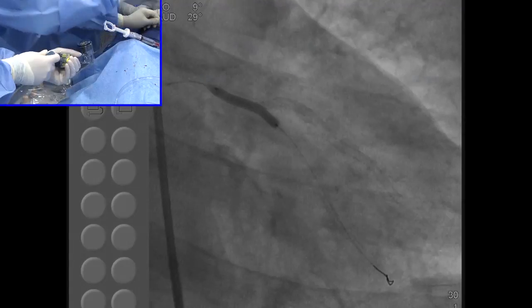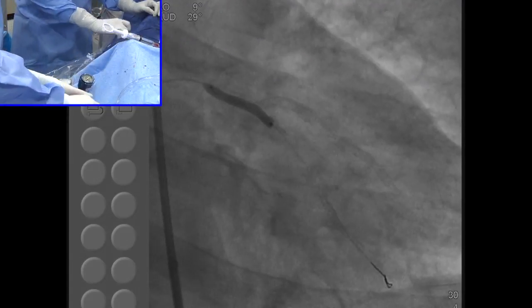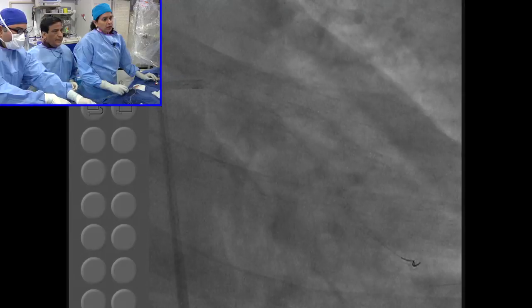This one should be... All right, then last will remain. We are getting to our time, and hopefully it looks good. Okay, I think that clearly I crushed it. It's going to look excellent.